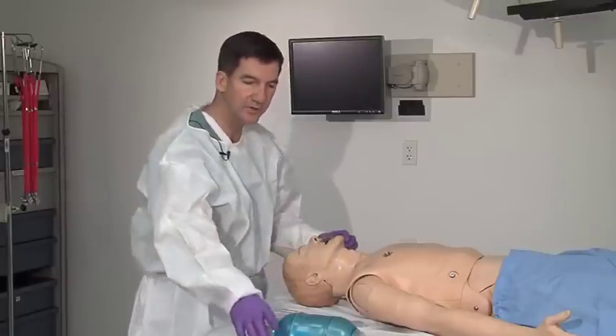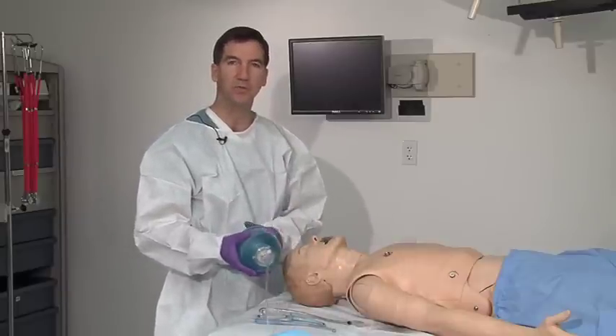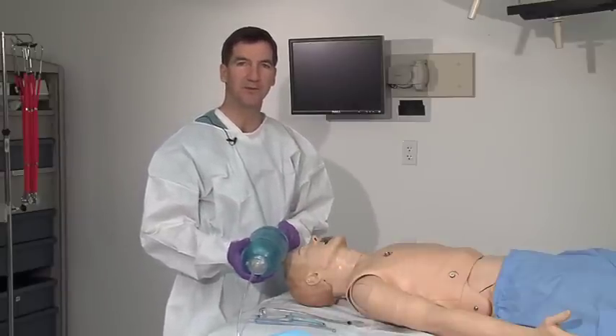Then you'd want to go ahead and start bagging your patient with the bag mask device.